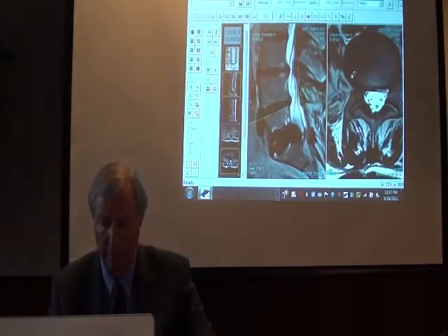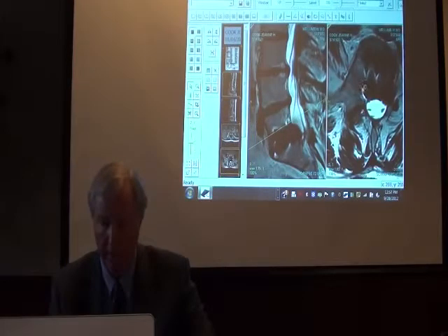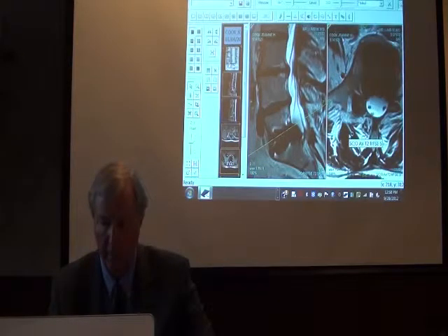So you go down to L5-S1, and you'll see the thecal sac, which has a round appearance. You'll see a big difference in the way this looks as compared to above at L4-5 or L3-4. Again, a lot of room at L5-S1.